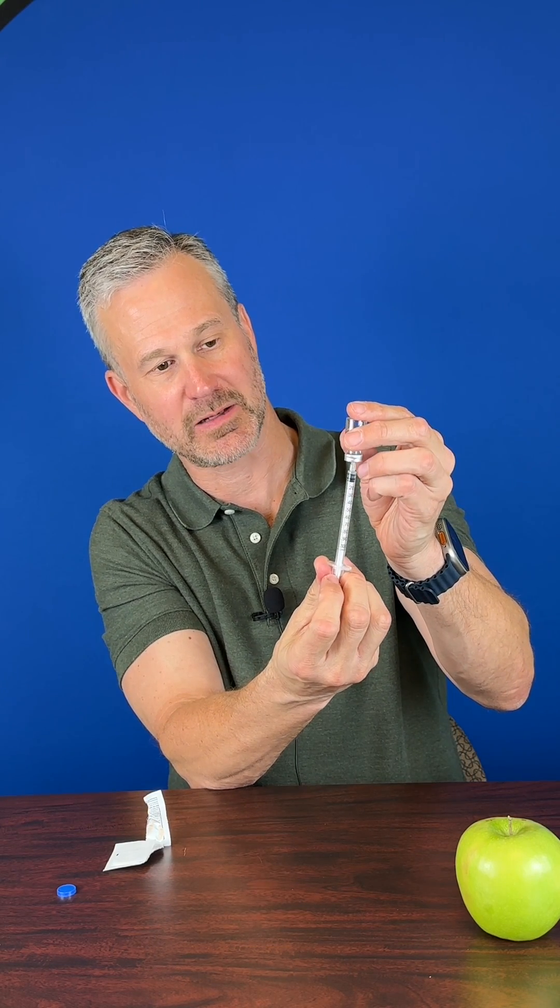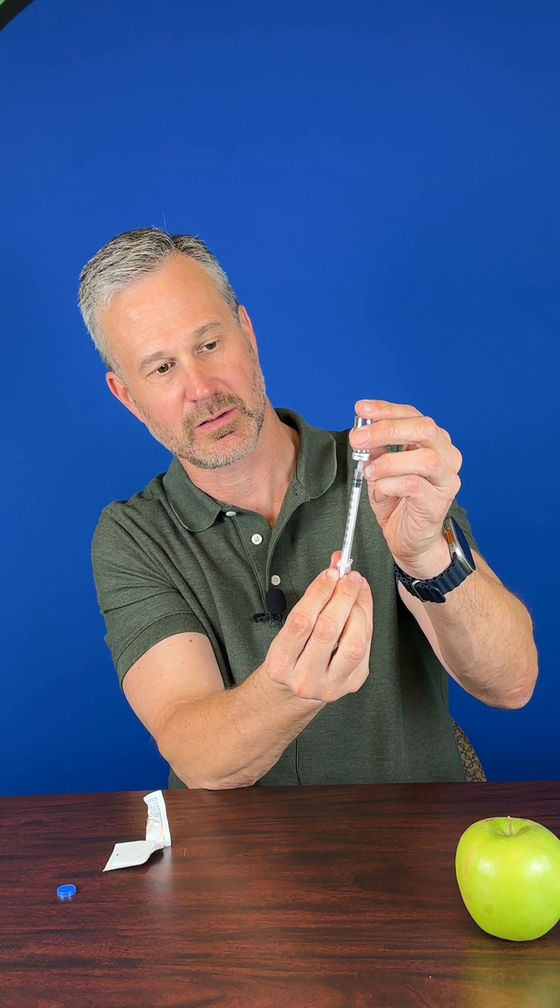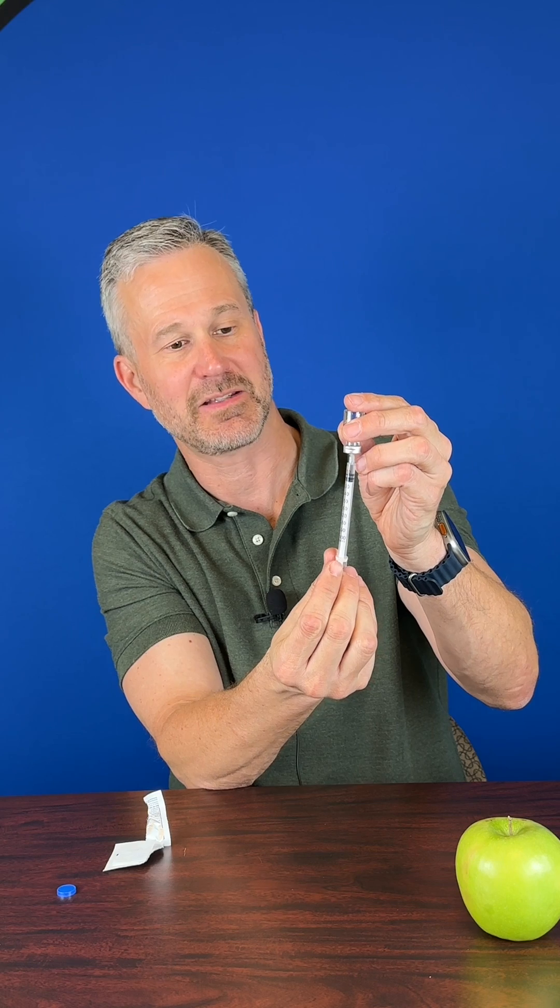Pull back the medicine so that the syringe fills with your medicine. When you get to 10 or just past 10, stop.